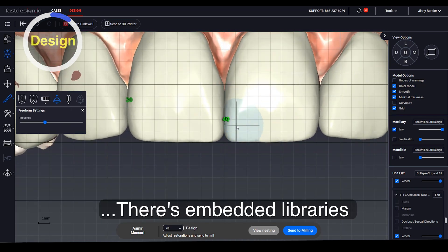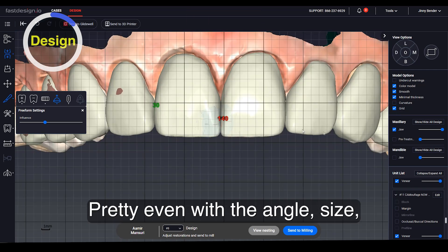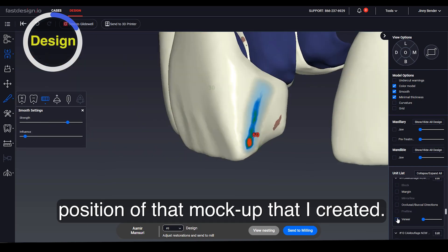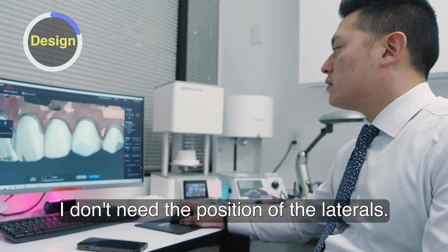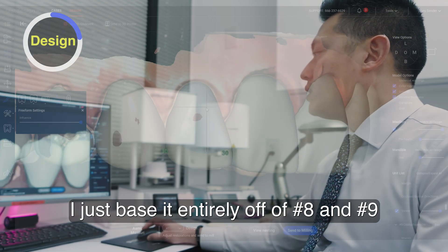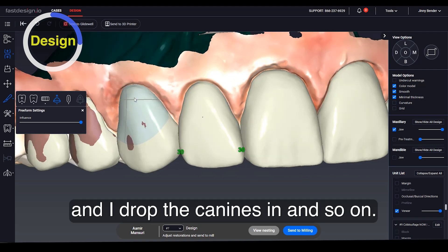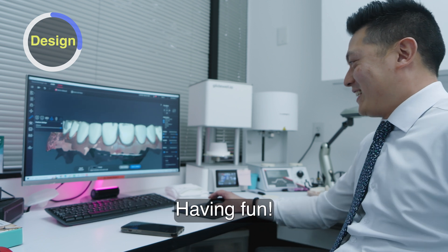There are embedded libraries in the design software. I position teeth 8 and 9 first, pretty even with the angle, size, and position of the mock-up I created. From there, I don't need to independently position the laterals — I just base it entirely off of 8 and 9. So I drop the laterals in, drop the canines in, and so on. Then I check from side to side, making sure everything flows.